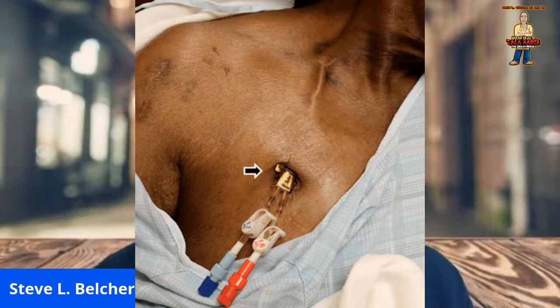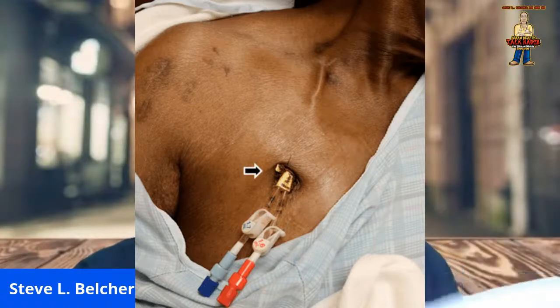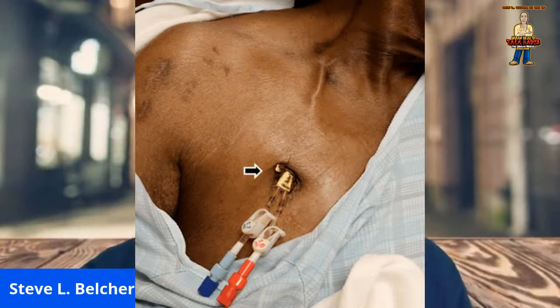So when that happens, these sounds notify the care team when the alarm goes off that your catheter or vascular access is not allowing a free draw of blood. This can be a sign that a clot is forming in the catheter, blocking the flow of blood.